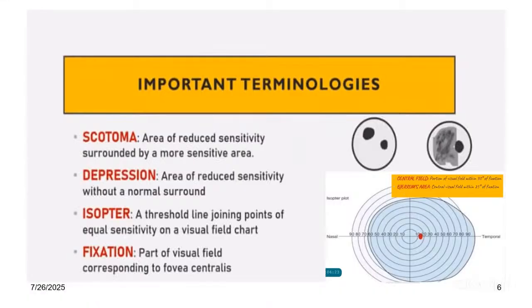While depression is an area of reduced sensitivity without a normal surrounding area. So this explanation is for the depression.